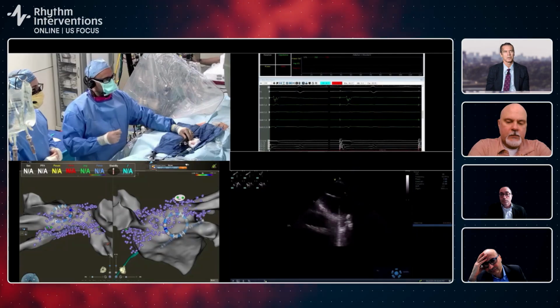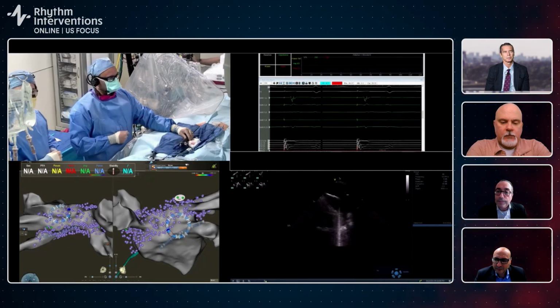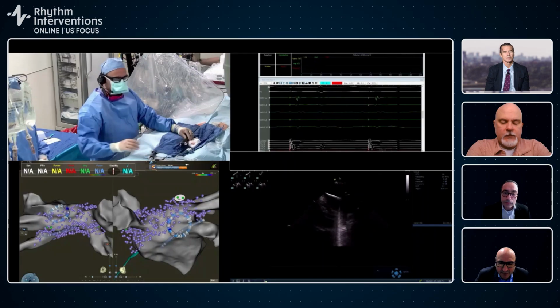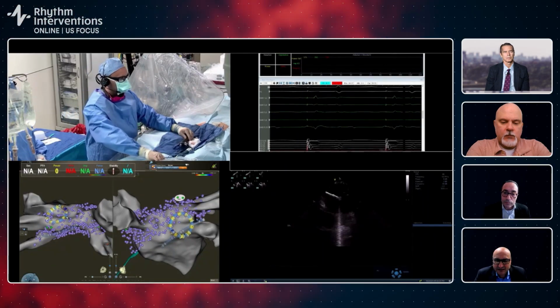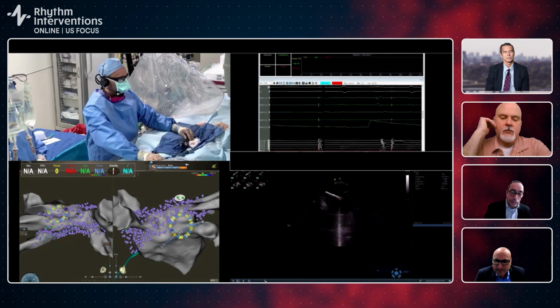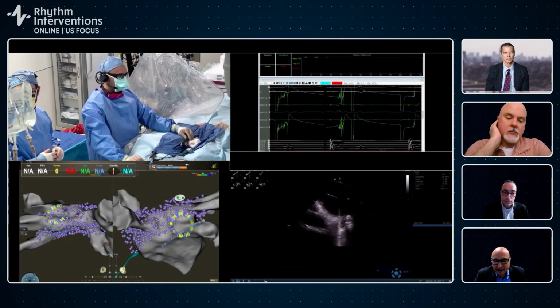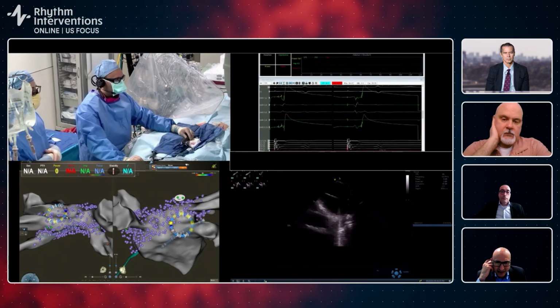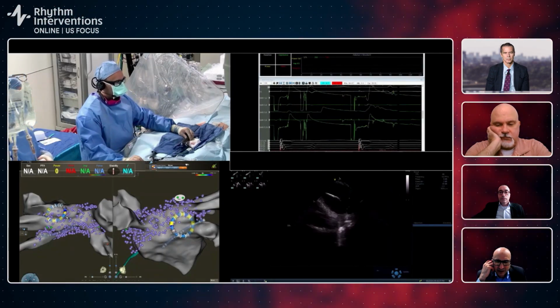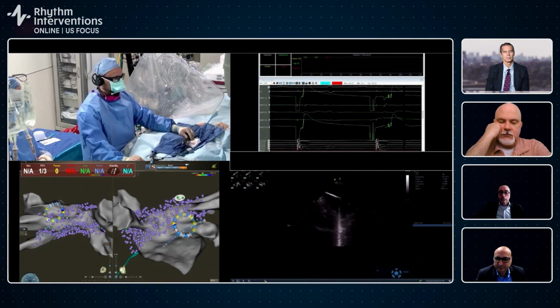We have to wrap this up soon. Any other comments, Moussa, from your case? No, not more than we mentioned. It's a versatile system, pulse field ablation. We talked about that. 10 electrodes. You can choose any. You can eliminate some of them if you don't need to. And it just got approval in the United States last week.